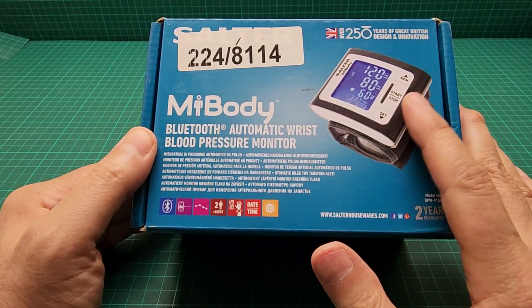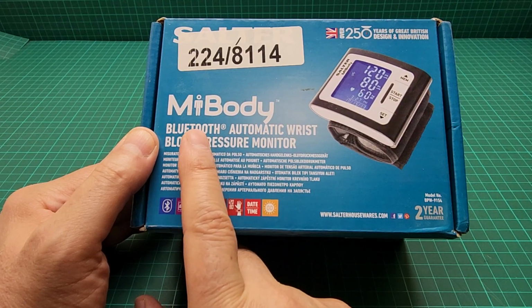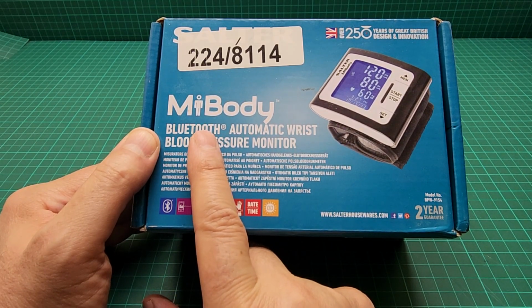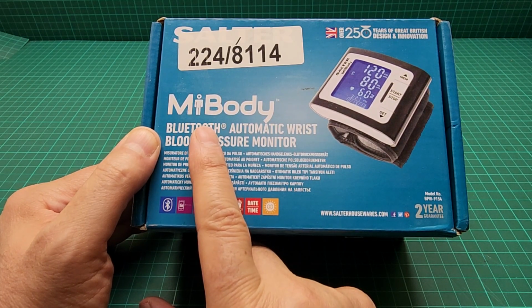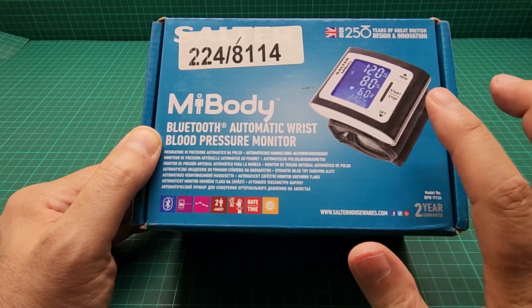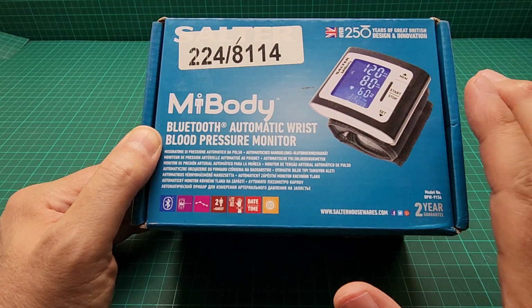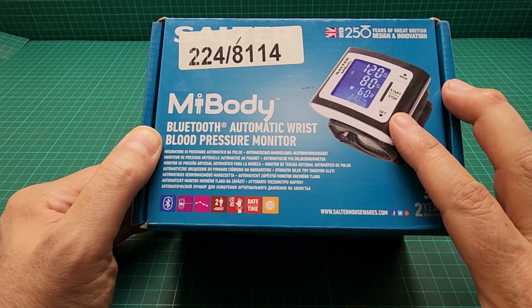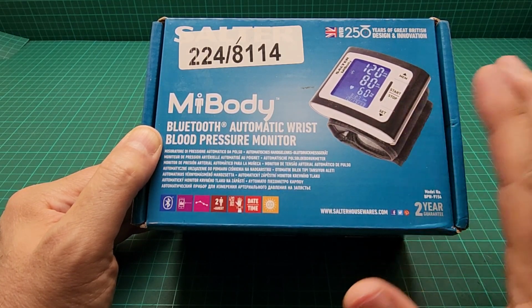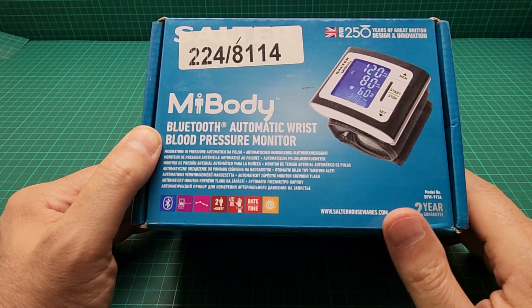And there is some caveat with this, because it has Bluetooth, just to let you know right now: if you register this item on your Bluetooth app that is provided online, I'm afraid if you forget your password or username or something like that... This one has 3 users, 1, 2 and the guest. If you use user 1 and 2 on the app and then forget your password and so on, user 1 and 2 don't work anymore until you find your password and username. But the guest is still going to function.